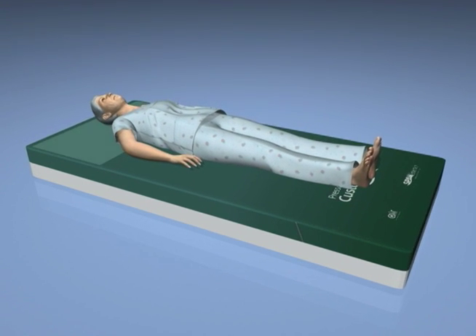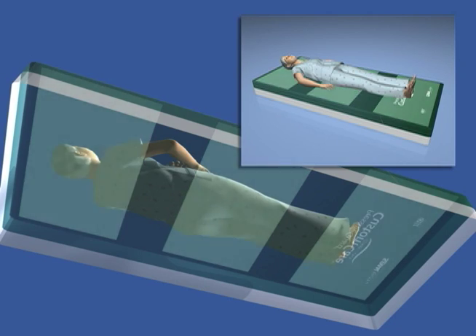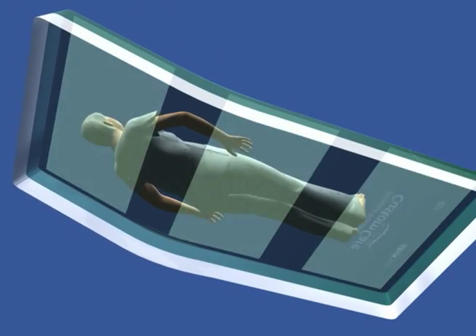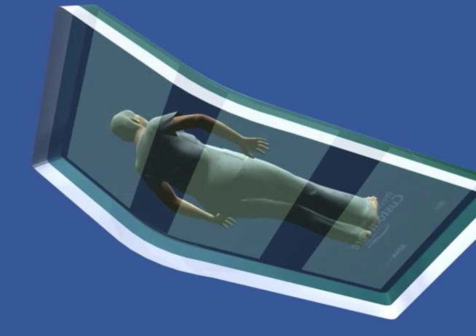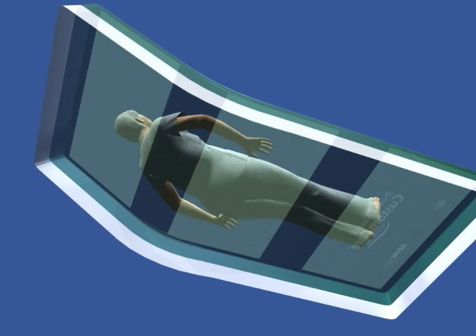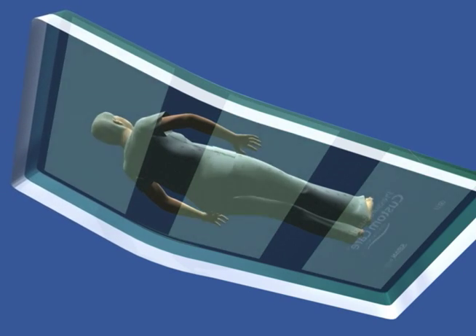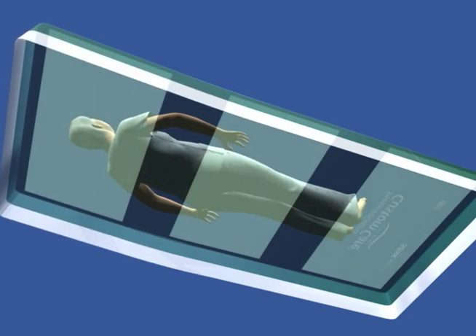Beneath the scapula, sacrum, and heels lie the shear minimizing bands of the innovative shear transfer zones. This design diminishes shear forces by allowing the user to glide smoothly forward during head of bed elevation, and when it's time to return the user to the recumbent position, the shear transfer zones minimize shear by helping glide the user back towards the original position.